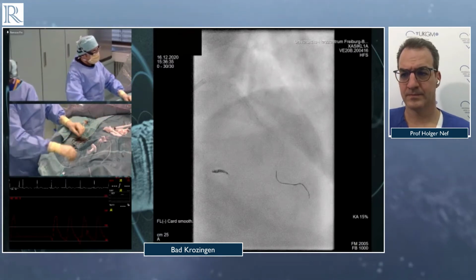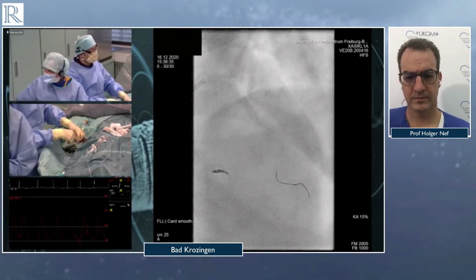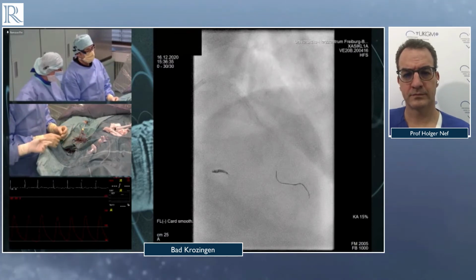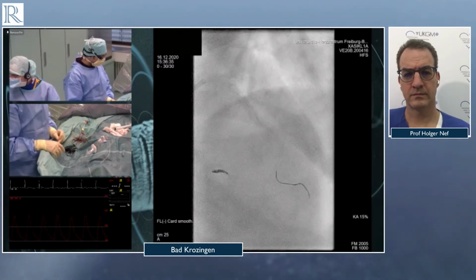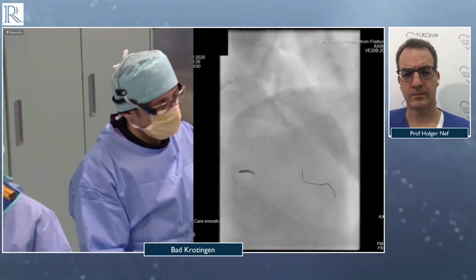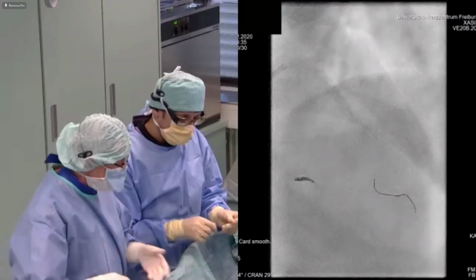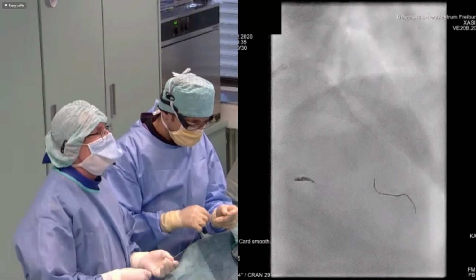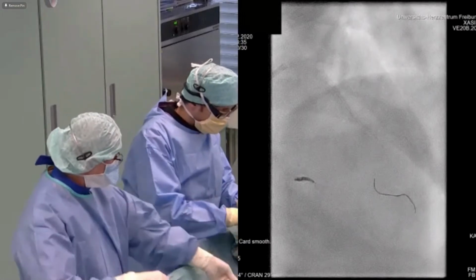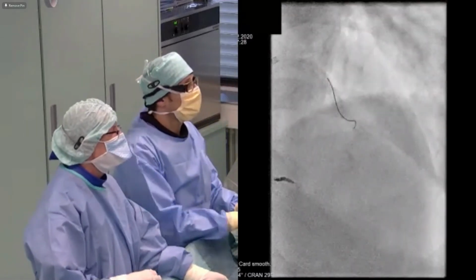So here I really like to have an idea about, could we modify the plaque in a way? Did we have a disruption of calcification? So therefore, I really would go for imaging in eccentric calcification. But also here, if the balloon is opening very nicely, the chance that you really have a good plaque modification is very high, right? But also for stent optimization, we know that the data are out that imaging has an impact.